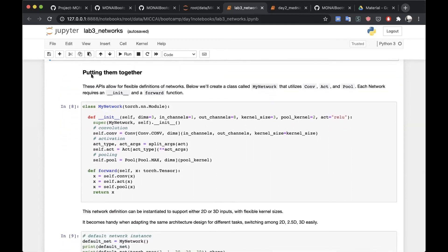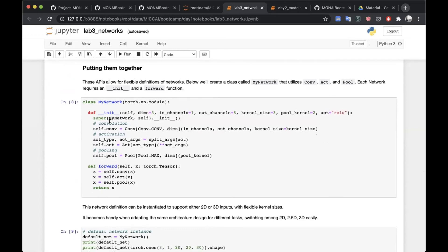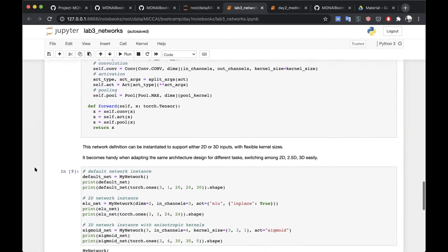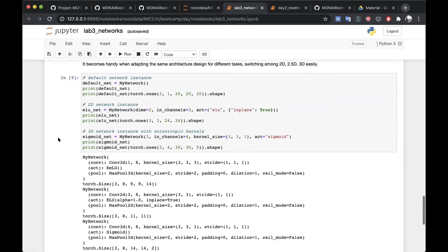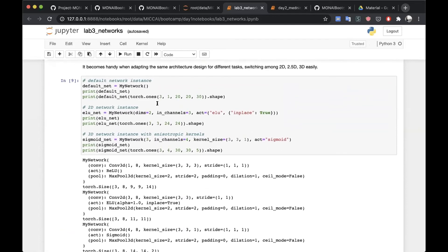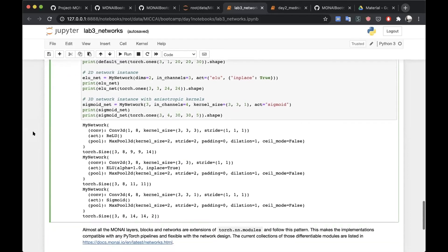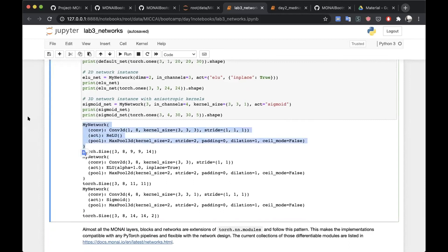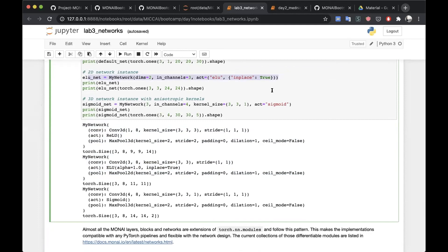We can stick all that together to create a network consisting of a convolution, activation, and pooling, then define the forward pass. We can use the network we've just created — we can create a 2D network, create a 3D network, and at the end print each one. This is the default network, this is the 2D network we created, and then lastly we can create the 3D network and print it.